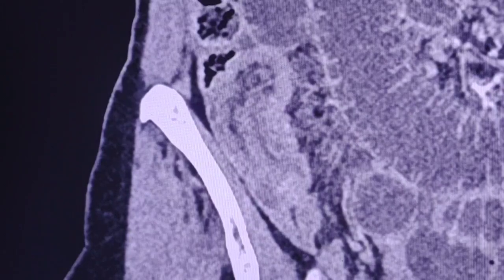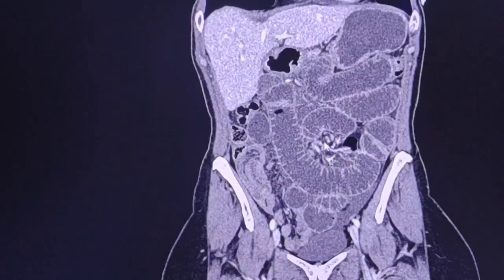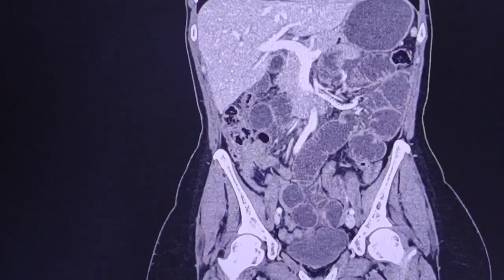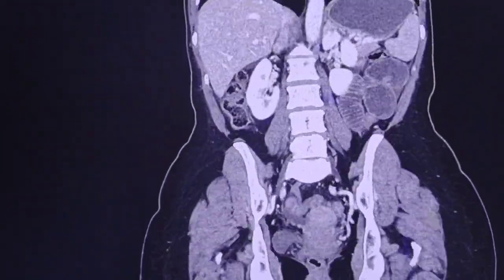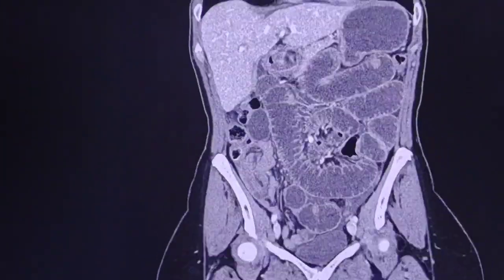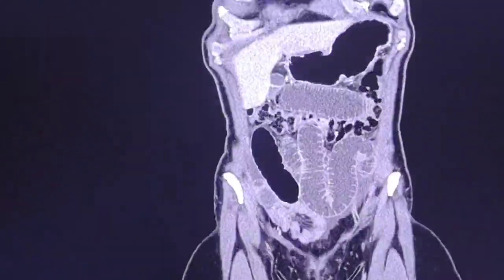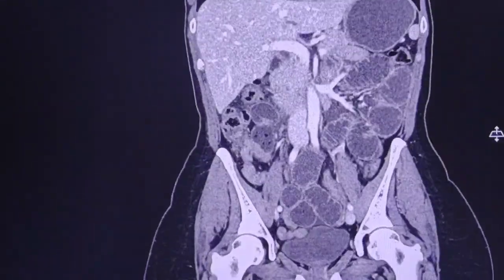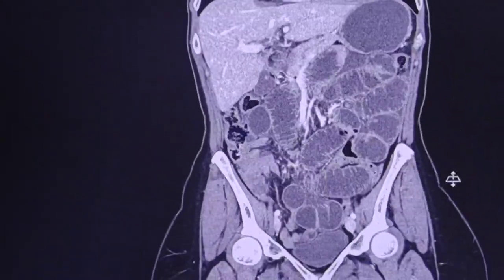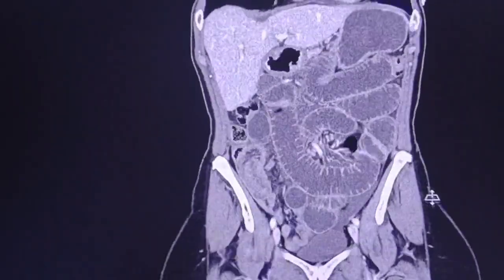I will scroll the images and you can see there is significant dilatation of the small bowel. This is in coronal views.